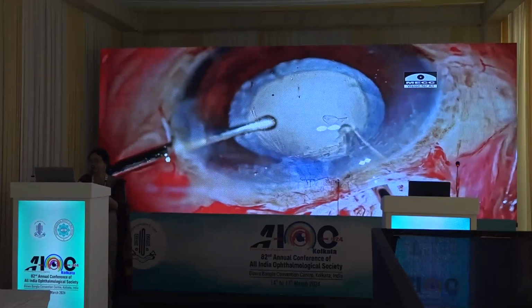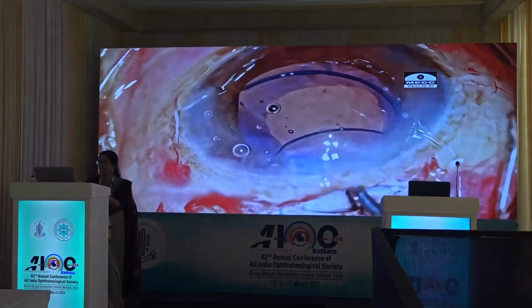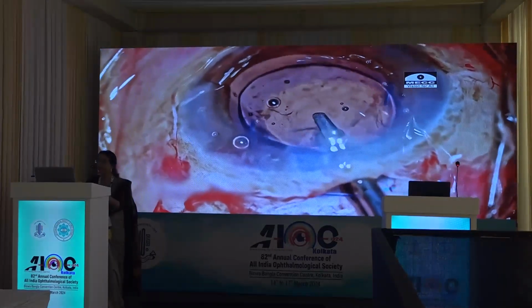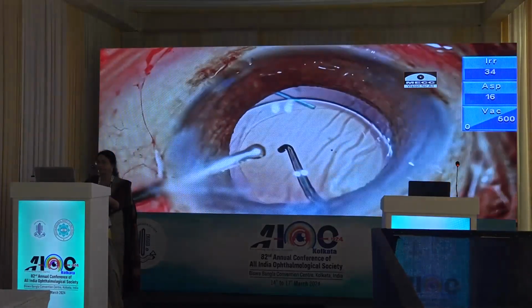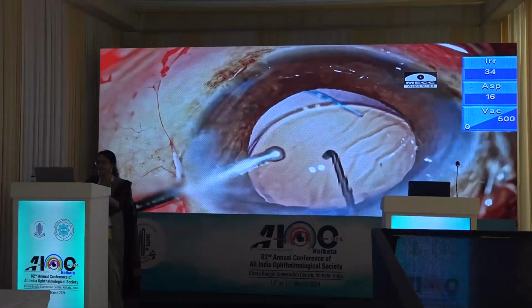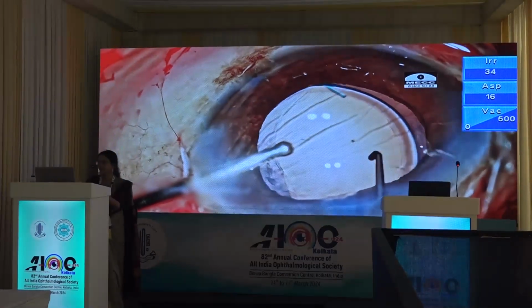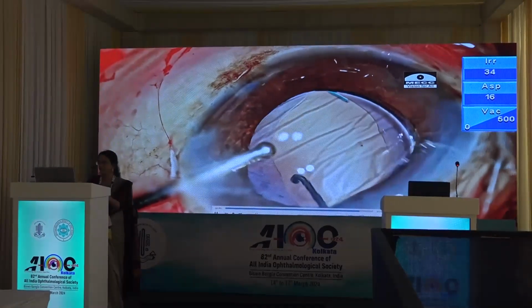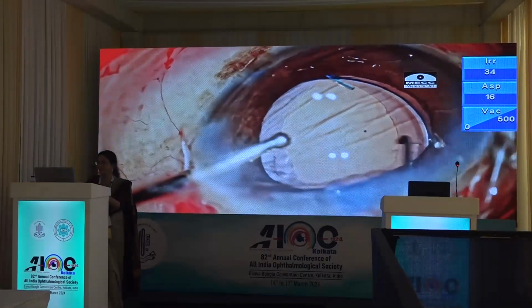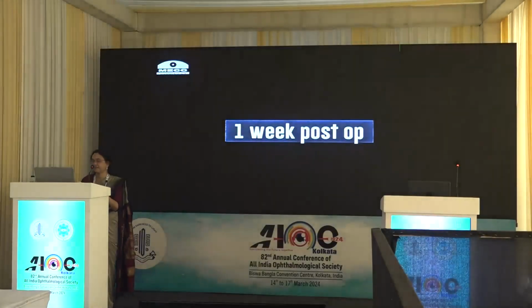Generally, the vitreous shows a tendency to prolapse towards the main port, and that is where you need to be meticulous about your anterior vitrectomy. A multi-piece IOL is being implanted in the sulcus with the optic capture. So optic capture generally ensures long-term stability of the IOL.